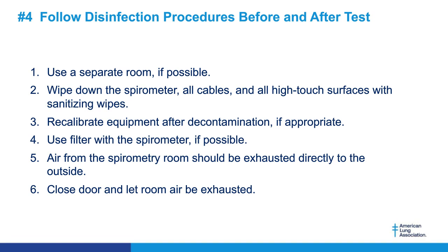The air from the spirometry room should be exhausted directly to the outside. That's what a negative flow room is. Some of my office spirometry people are saying they're opening all the windows. I think that's a great idea. Anything to increase the ventilation in the room. And then you close the door and let the room air be exhausted.